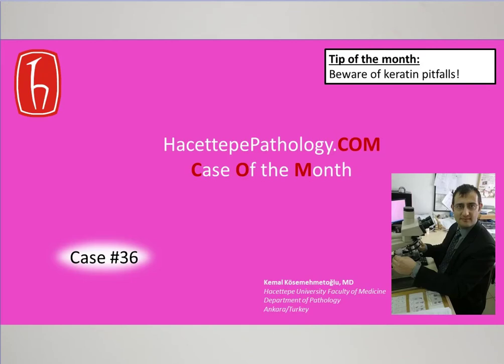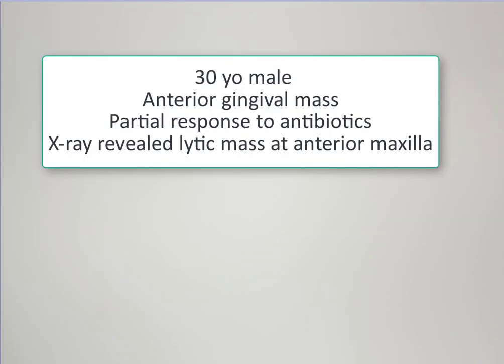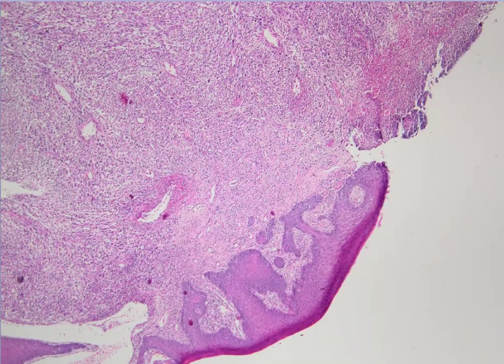And this month I'm going to present a 30-year-old male patient with a gingival mass. It has been treated with antibiotics, but it doesn't resolve, so they took an X-ray showing a lytic mass in the anterior region, and here is a biopsy from this case.